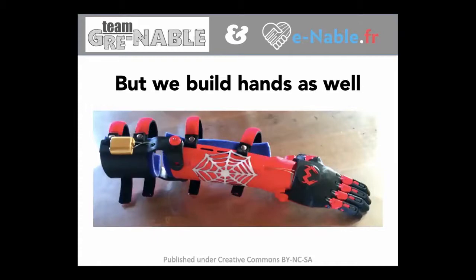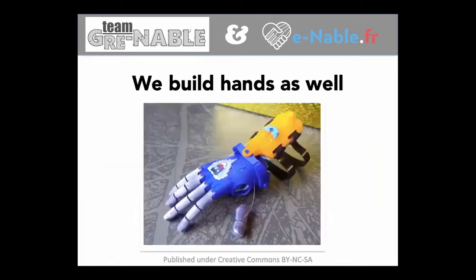So this was our first Enable delivery. The little boy was very happy, called Matteo. He wanted a logo with an M. He liked Batman. So we built hands. And we also have a flexible hand, which is special because the boy has a small part of a thumb. So we have to remove the thumb from the original and put in an extender of the thumb. So that was, I would say, the catalog hands.